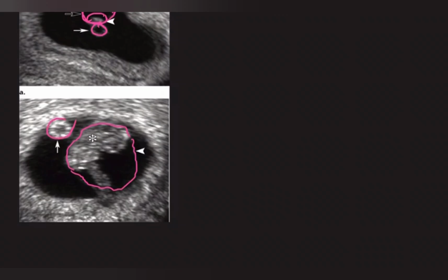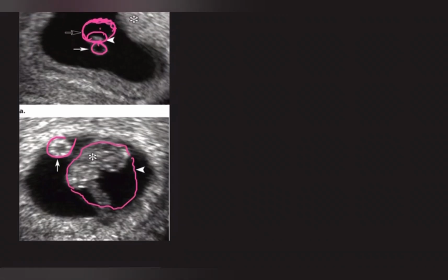Okay, so these are the early stages of development of the gestational sac, and this is actually the chorionic plate, which will further develop into placenta.